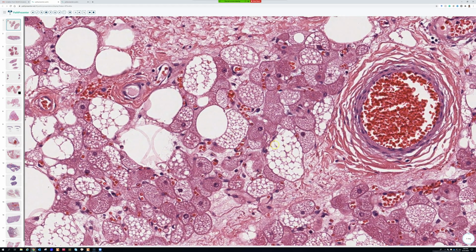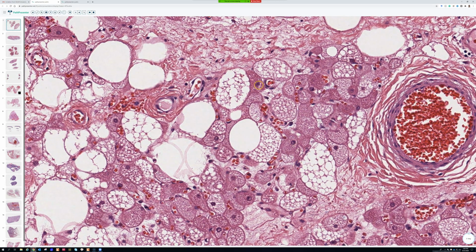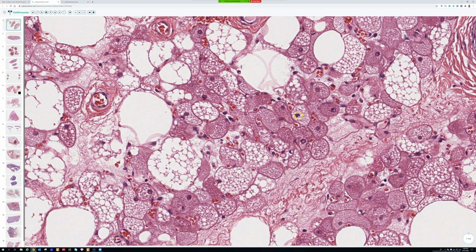Yeah, there's no nucleus in this plane of section for this one, but the nuclei will look similar to these. They're round, uniform nuclei, and they have central prominent nucleoli. That nucleolus is normal for hibernoma, okay? Don't get worried or think that's atypia. That's normal. And just like in a lipoblast, because these are lipid bubbles, they are clear and very sharply circumscribed, and they indent the nucleus because they're not compressible and they push everything else out of their way.